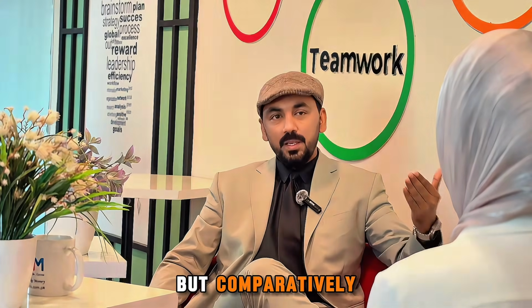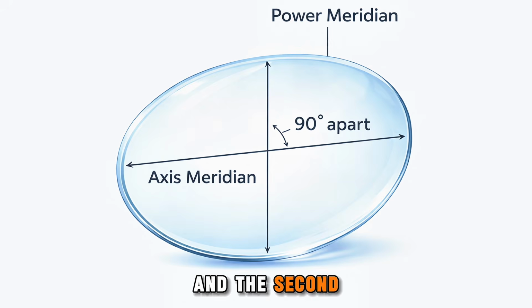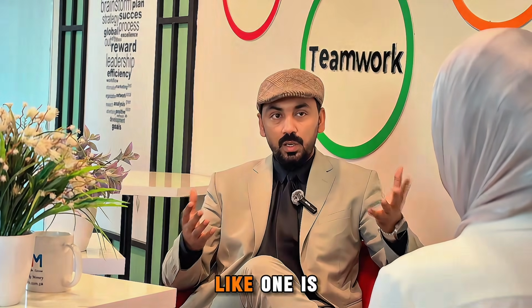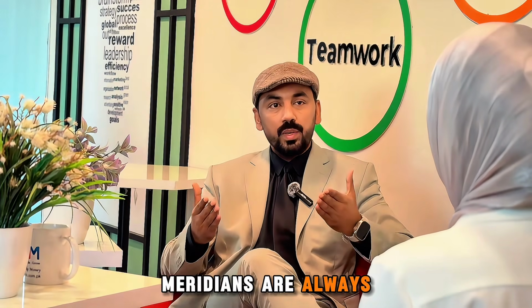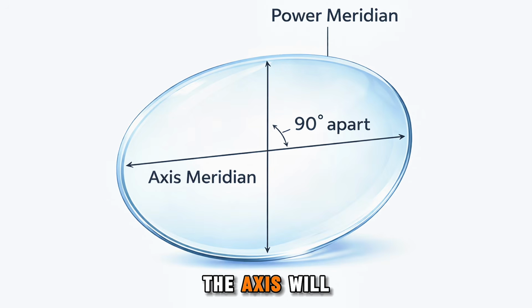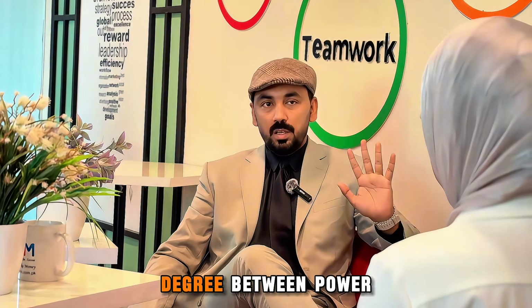But comparatively, in toric lenses or cylindrical lenses, you know that in astigmatism there are two principal meridians, right? One is called the axis meridian and the second one is called the power meridian. So in a cylindrical lens, we have two meridians, one is power and the other is the axis, right? And you know very well, axis and power meridians are always 90 degrees apart from each other. If power is at 90 degrees, the axis will be at 180 degrees. There is a difference of 90 degrees between power and axis.